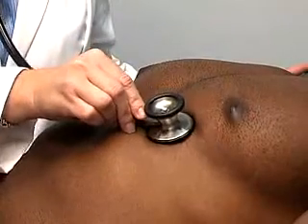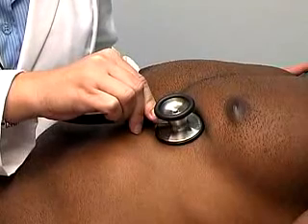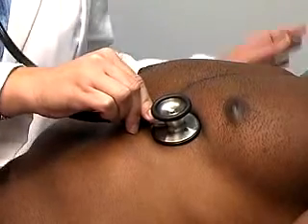The large flat surface of your stethoscope is called the diaphragm. Press the diaphragm firmly against the skin to optimally hear most sounds.